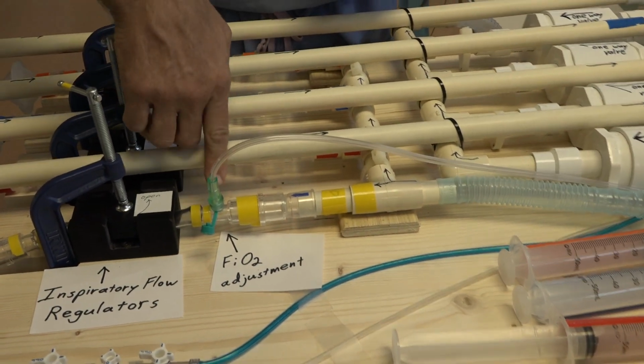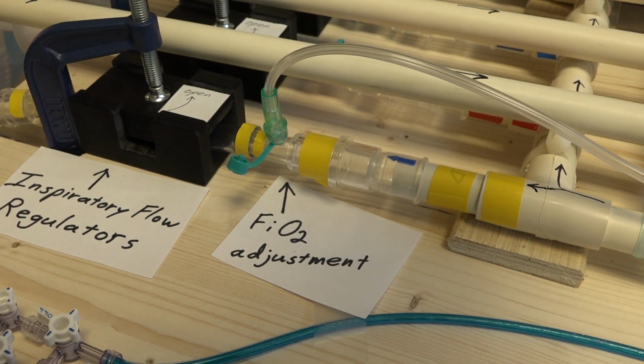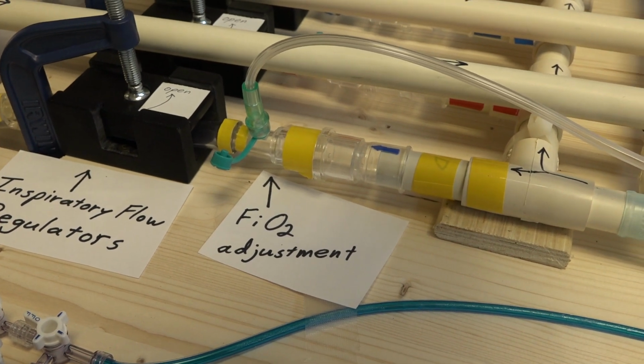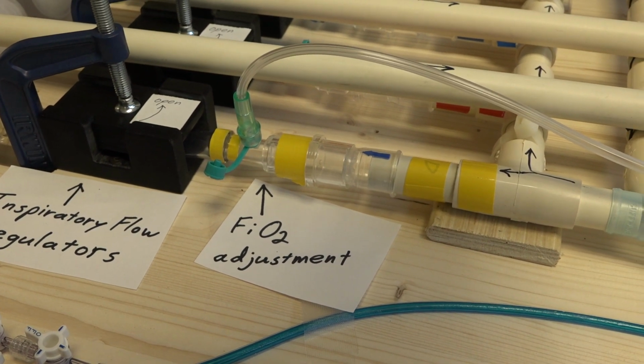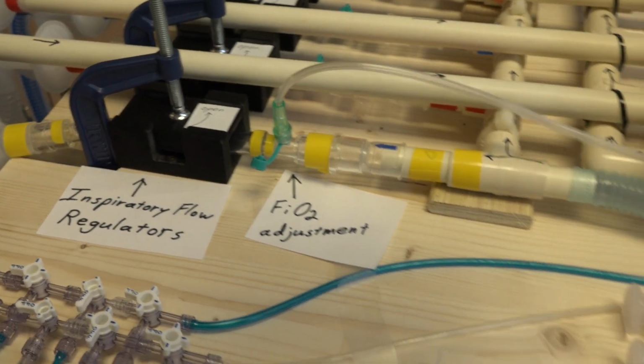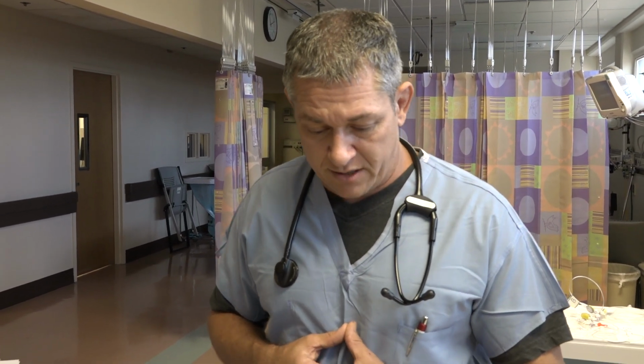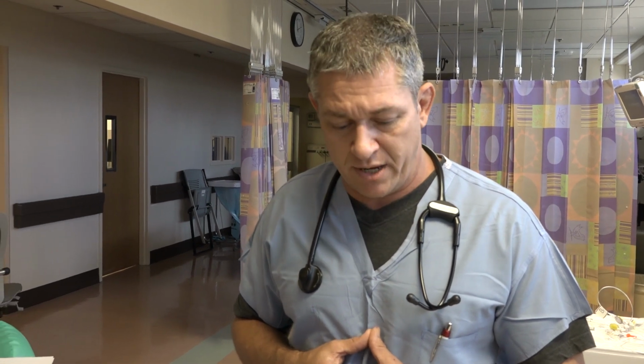Next, you see an auxiliary oxygen supply. With this, we can individualize a patient's FiO2. In addition, potentially you could add nitric oxide to each individual patient. I know there's a lot of research into that as a possible new advancement for the treatment of COVID-19 patients.